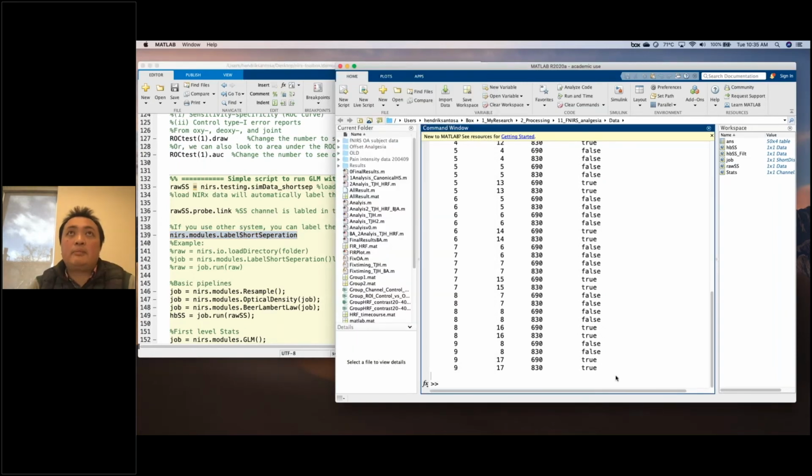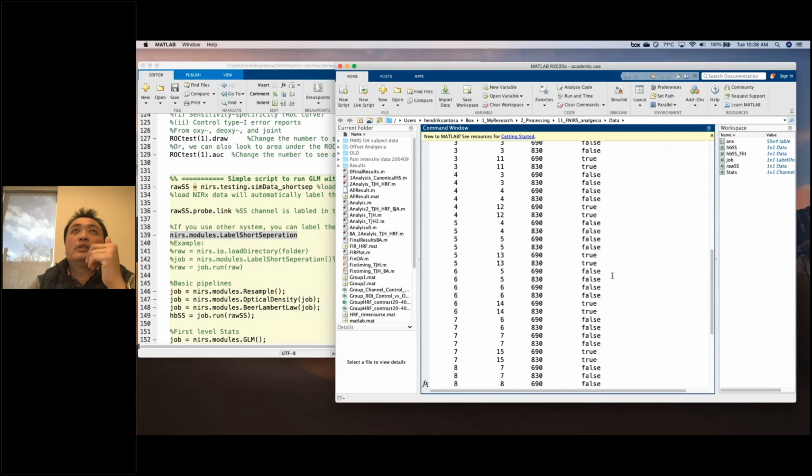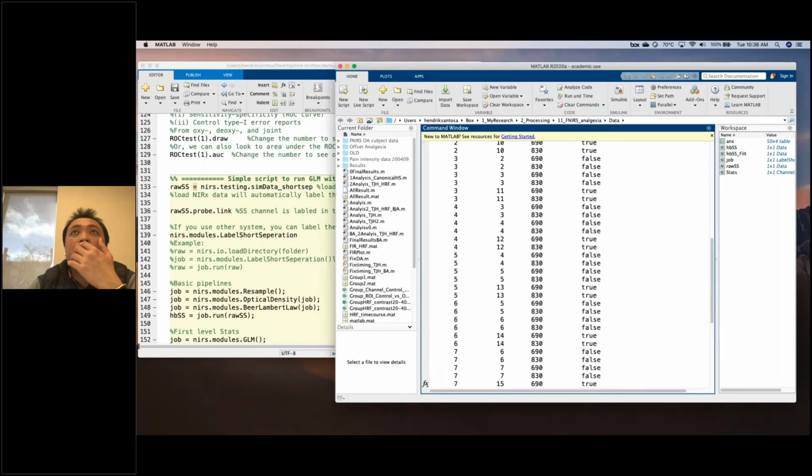For example, you can type job, and you can see the maximum distance is 15 millimeters. So it means if the distance is less than 15 millimeters, it will label true for the short separations. You can load other data, not NIRx data, give the job for labeling short separations, and run this one. In the end, you will get the same thing as this one.